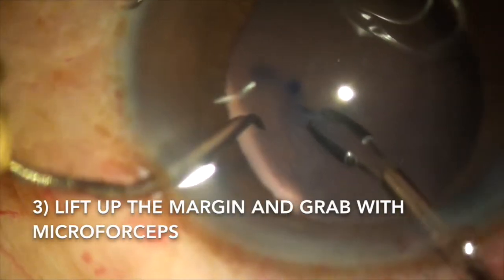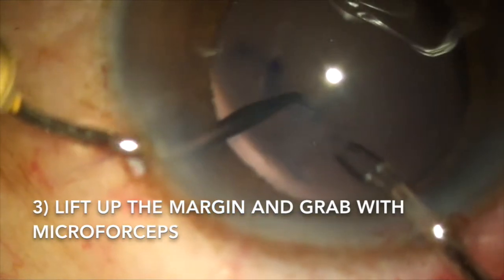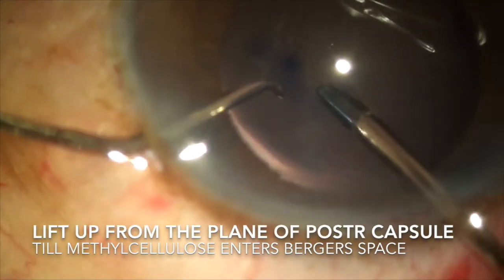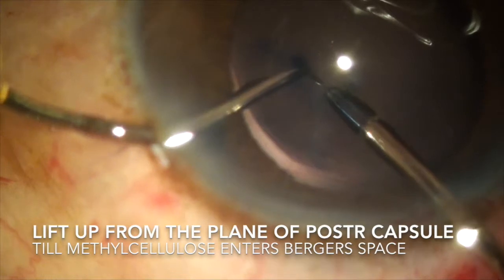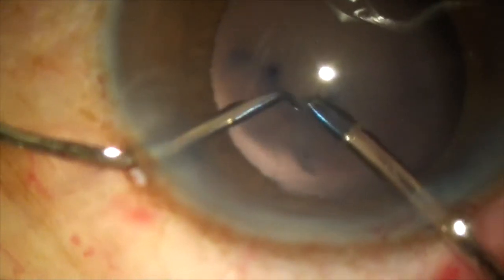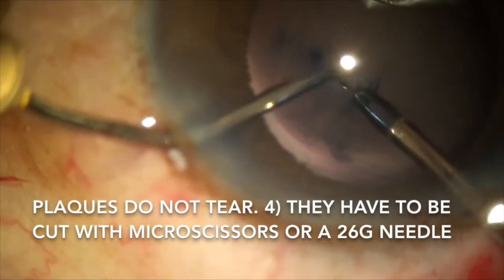Lift up one of the margins of the torn posterior capsule. At this point you will see the methylcellulose flow into the retropseudophakic space behind the posterior capsule. As soon as we grab the lip of the torn edge, we have to gently lift it about half a millimeter above the plane of the posterior capsule, away from the vitreous. We have to lift it up towards the pupillary margin.